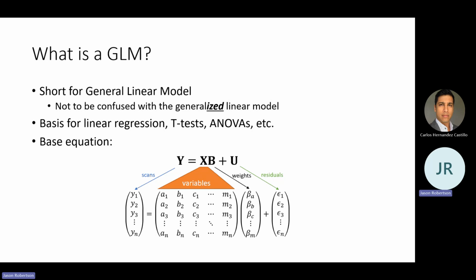So we expand this out, and you can see how it's expressed as linear algebra. I labeled the different variables as different things. For example, the first two columns might say which subjects are control and which are patient.